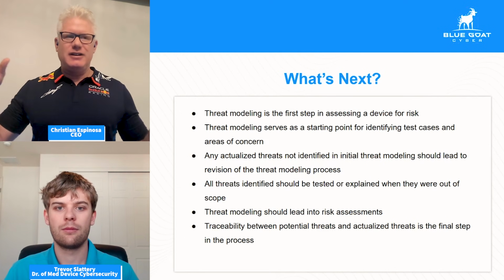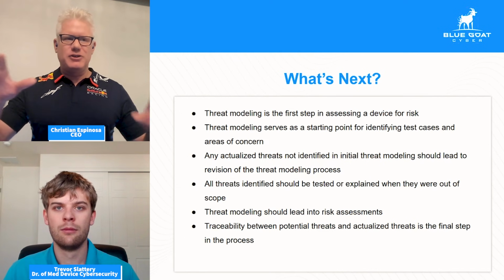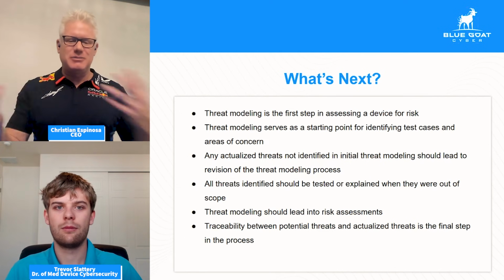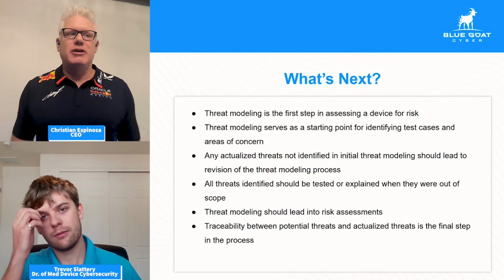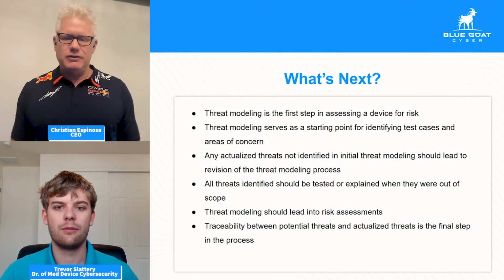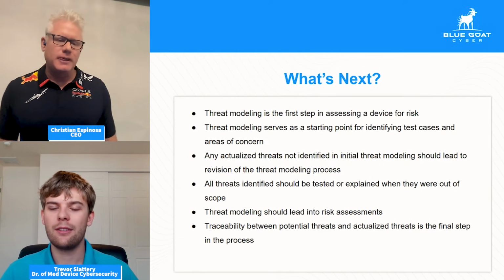It sounds great in normal traditional cybersecurity, but if this doctor can't get into that device because it's too complicated, then what is the risk to the patient, right? So it's a little bit different lens. A lot of people try to look at it from traditional cybersecurity, like you have to do all this stuff, but we look at it like, what is the actual impact of doing those things? It could have a negative impact. Multi-factor authentication is not always necessary, as an example.